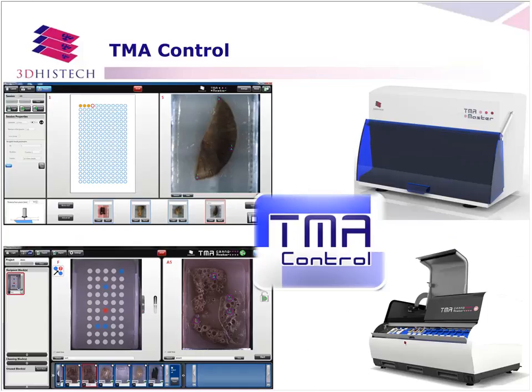You can control both of our machines with the TMA Control software. If a TMA Master is connected to the control computer, the TMA Control software will load the TMA Master specific components, or it starts in TMA Master mode. If a TMA Grandmaster is connected to the computer, the TMA Control software will start in TMA Grandmaster mode.